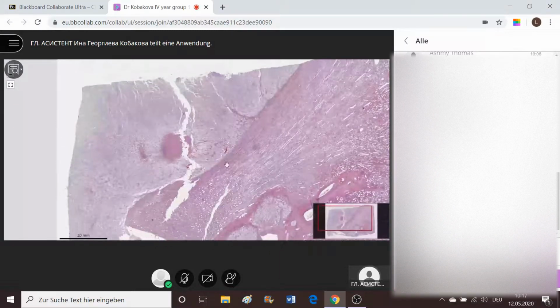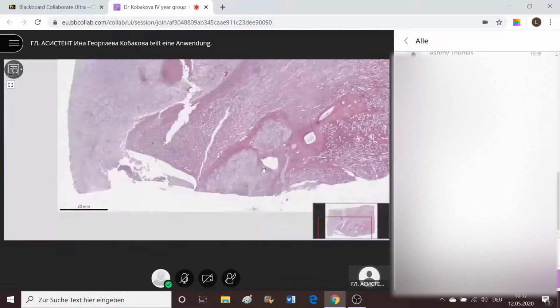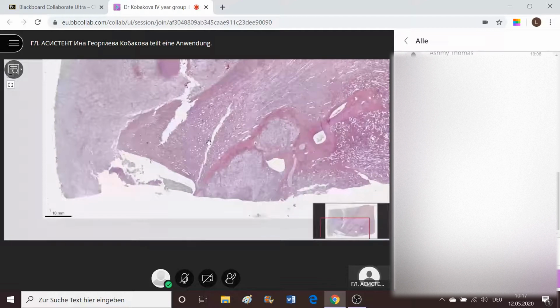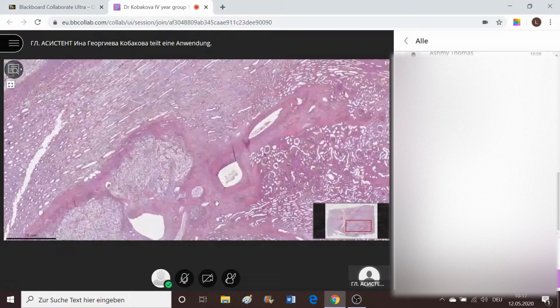You might say that here are a couple of nests which you observe further, trying to be away from the major tumor field, might be considered as infiltration. But since you don't have a picture of all of the kidney, I think you should not be sure about this one.